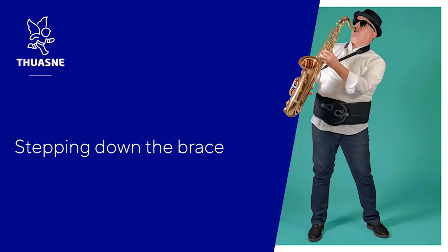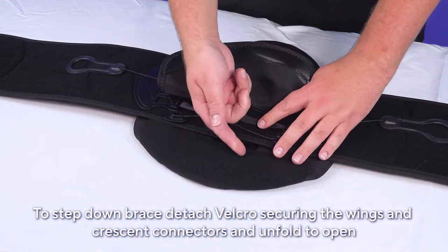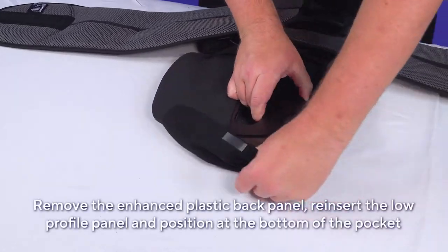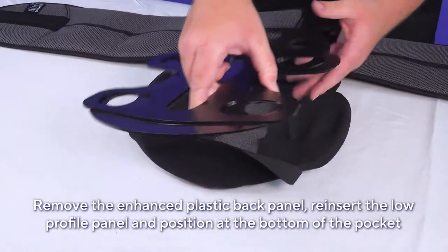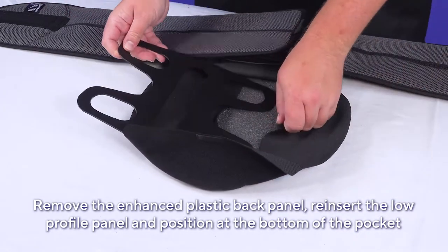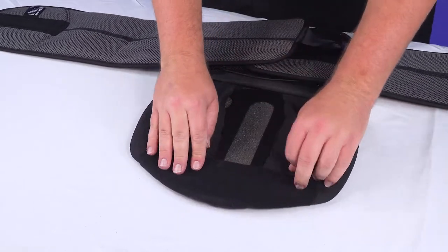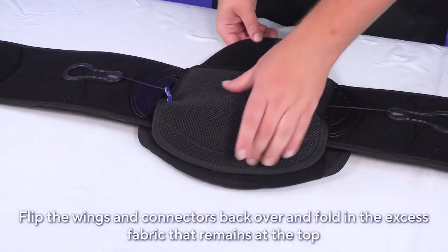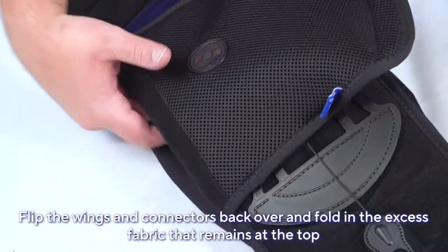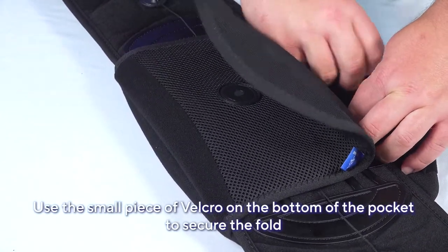Stepping down the brace: Detach the Velcro securing the wings and crescent connectors from the back and unfold to open. Remove the enhanced plastic back panel, reinsert the low-profile panel, and position it at the bottom of the pocket. Flip the wings and crescent connectors back over and fold in the excess fabric remaining at the top. A small piece of Velcro attached to the bottom of the pocket can be used to secure the fold.